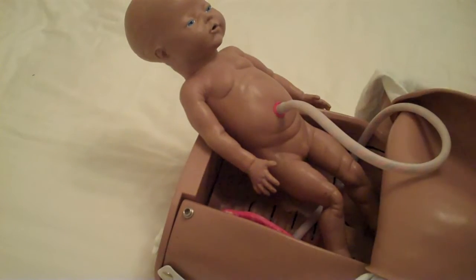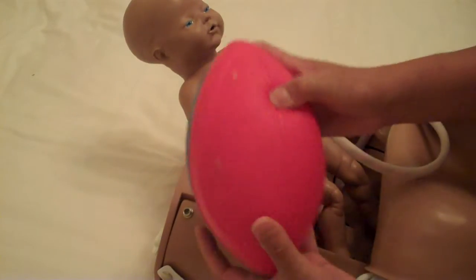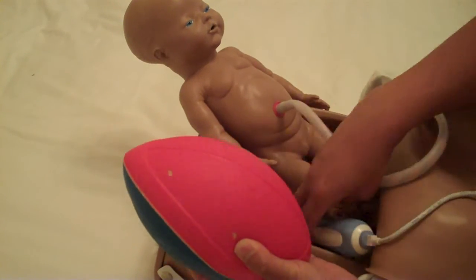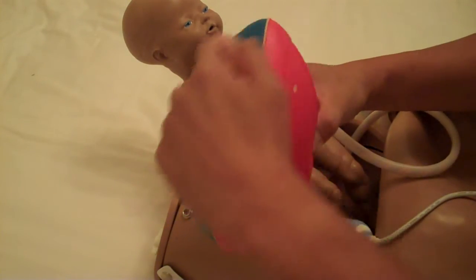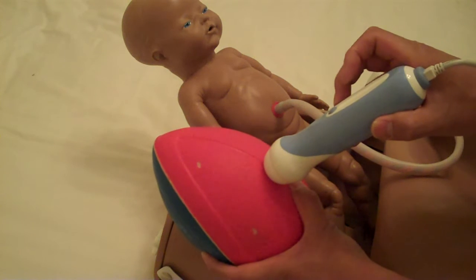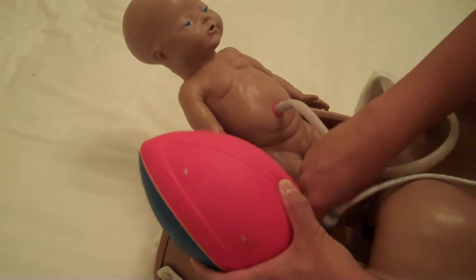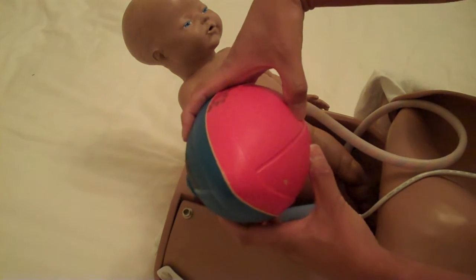Another example. We're going to use a football to illustrate the next point. So a football is not a sphere, it's an oval, right? So if we were to scan this football in this direction, we're going to be cutting it like this. So what are we going to see? We're not going to see a circle, but we're going to see this outline, which is an oval. Now, same thing. All I'm doing is turning it. So the dot now points this way. But I get a completely different image. Because if I cut this in the middle like this and look at it this way, I see a circle.